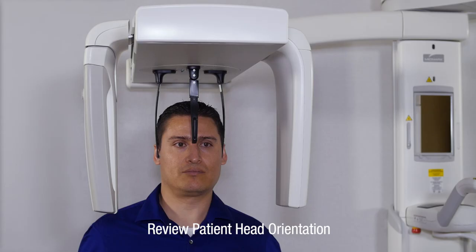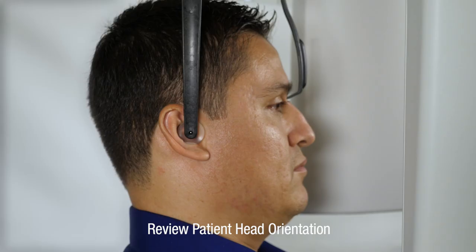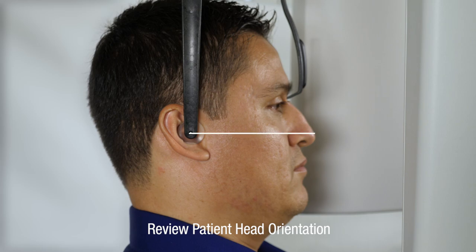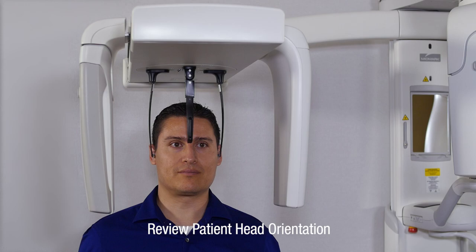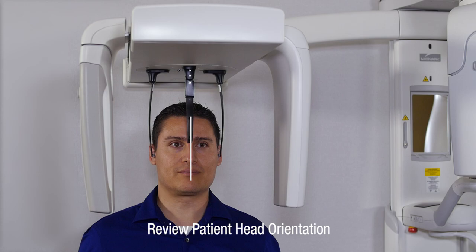The patient's head position should be reviewed to make sure it is correct along three axes. From a side lateral view, the Frankfort plane should be level horizontally. From a frontal view, the patient's face should be straight forward without any twisting. Also from the front, ensure the patient's head is not tilted but vertically straight.